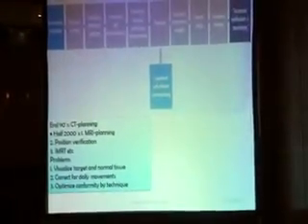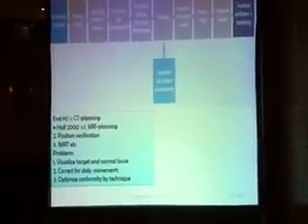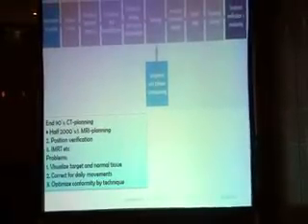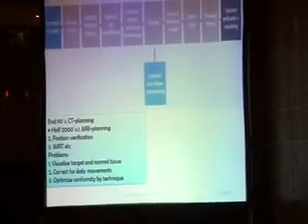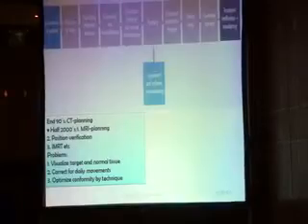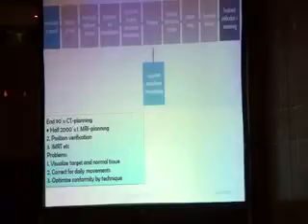This is to show you that the process of radiation therapy is a lengthy process. We spend much time in the planning session, and then treatment information transfer, patient setup, and treatment delivery, and Dr. Muhammad, of course, covered the treatment verification very well. And without verification, as Dr. Muhammad said, we cannot be sure what we are hitting. There is a famous saying, and I usually put the dart picture in my talks, that if you do not see what you're hitting, you are not killing it. So you have to see what you are doing every day, and hence the verification becomes very important.